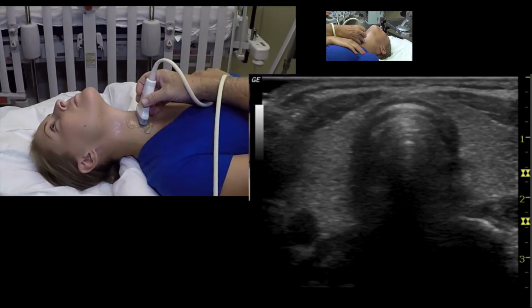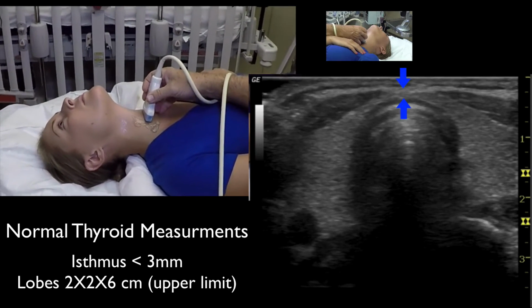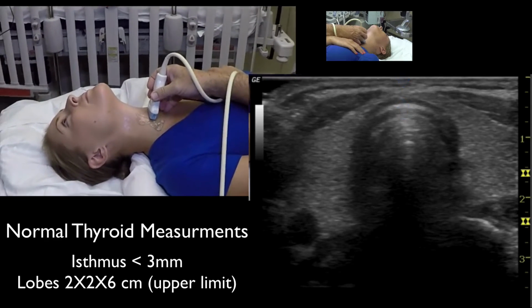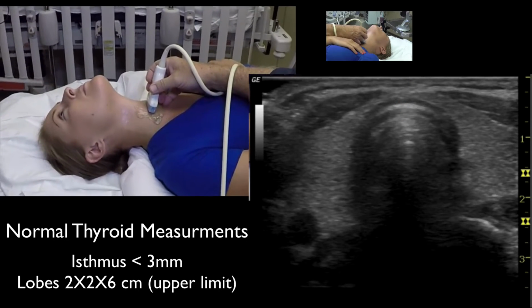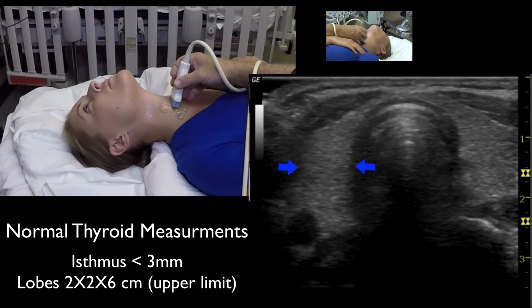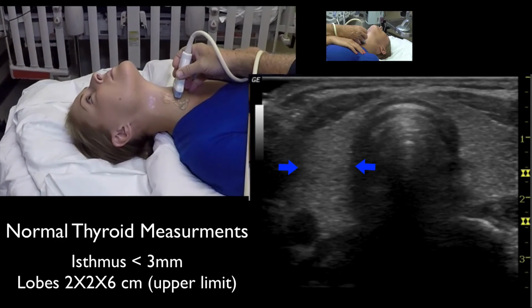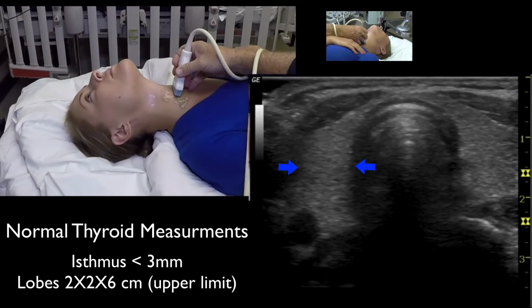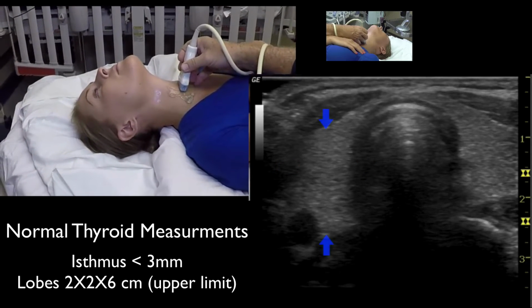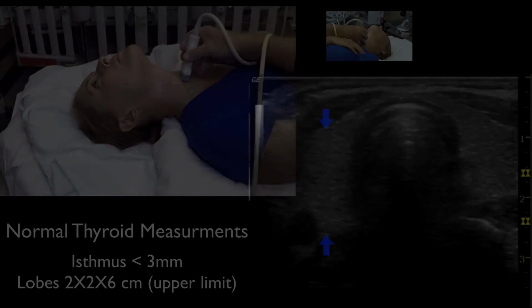We're going to want to measure the thyroid. Let me start first by measuring the isthmus. The isthmus should be 3 millimeters or less. Her isthmus is actually 1.6 millimeters, so it's clearly normal. I'm going to go ahead and measure the thyroid in its transverse diameter, and the thyroid should be less than 2 centimeters, and hers is 1.6. And we'll measure the AP diameter as well, and the AP diameter should be less than 2, and hers is 1.3.